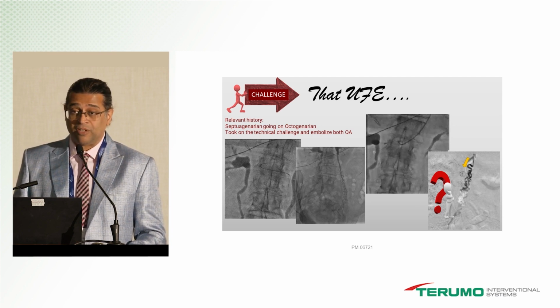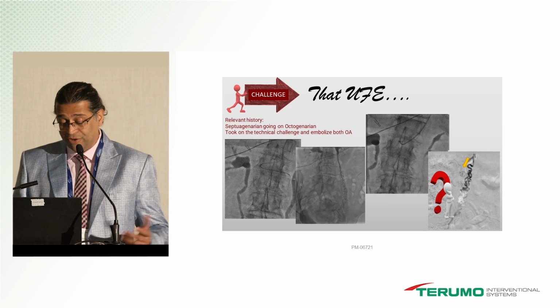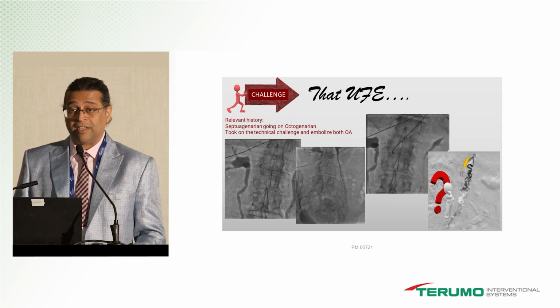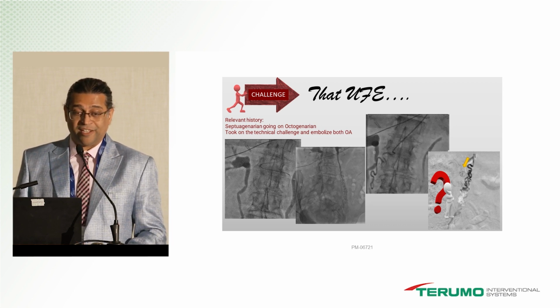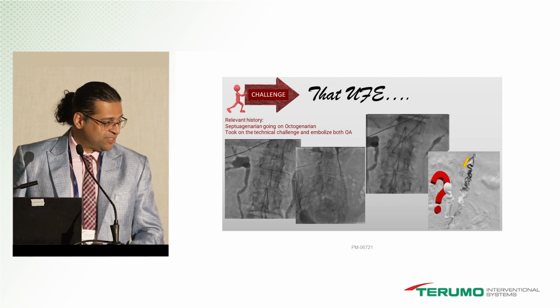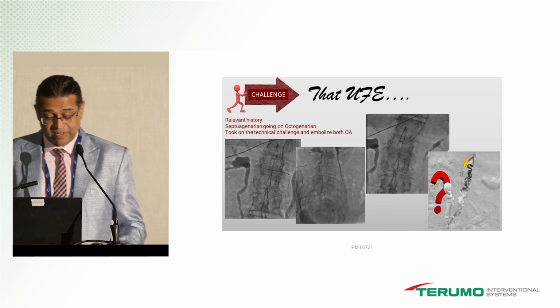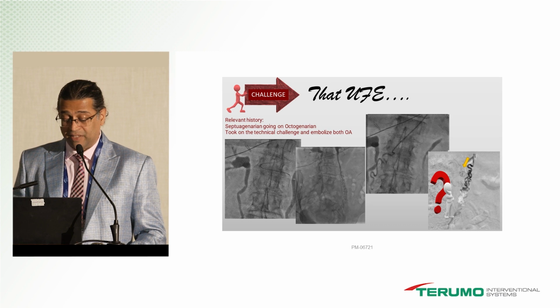The right side was even more difficult. So I tried to turn the catheter, and I finally got into the artery, and I went inside. Interestingly, this is an anomaly which I don't know what it is, but I saw this anatomy. Started putting beads, and the patient had acute pain in the right side of the abdomen. I stopped. I started again, pain. I'm thinking that these are small ureteric branches. It looked like it was a lumbar pain. I didn't really embolize this to stasis. I just embolized a little bit, just enough to get relief.